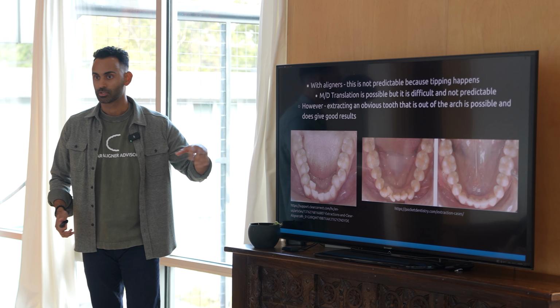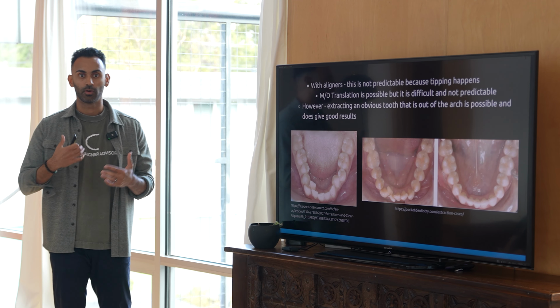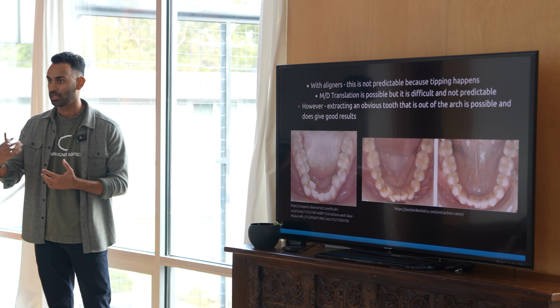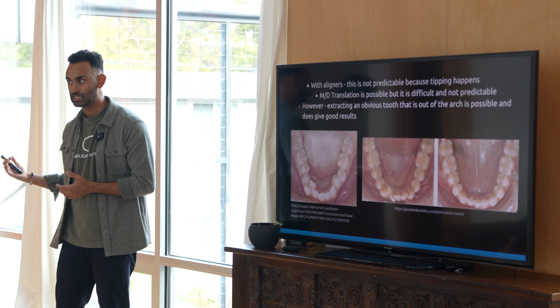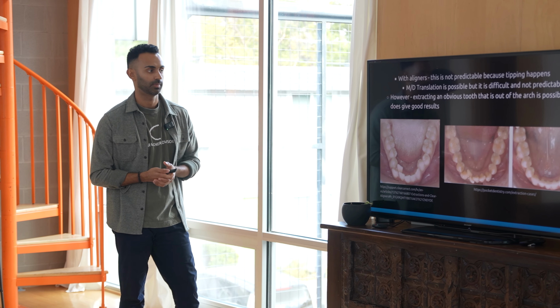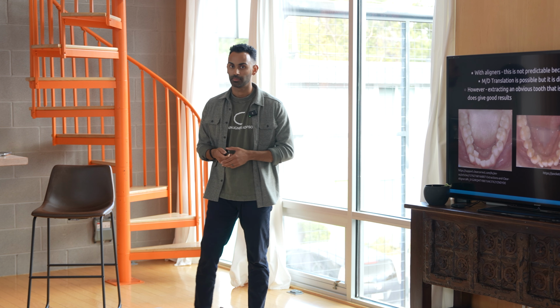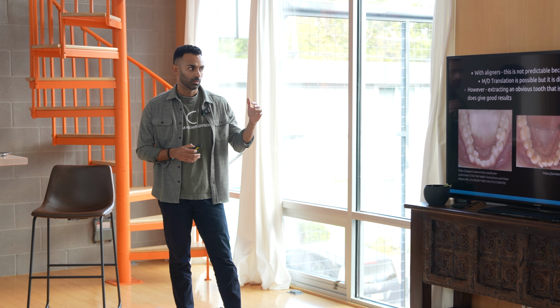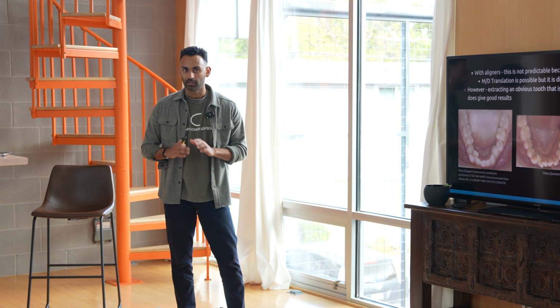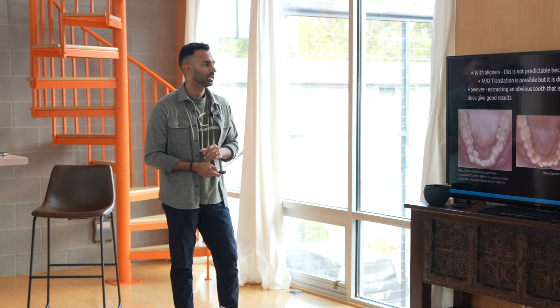So when you have a case like that, you can plan to just extract it, and then you immediately begin the treatment. The reason why you don't wait is because when you have an extraction site, you've already created that inflammation in the area. So that bone is going to want something to move into it. So you will be able to easily move teeth into the space that you need. And those are things, when we get into the case setup part of the talk, you'll be able to mark and identify. Like if you're planning an extraction, you can set that off from the beginning. Okay?